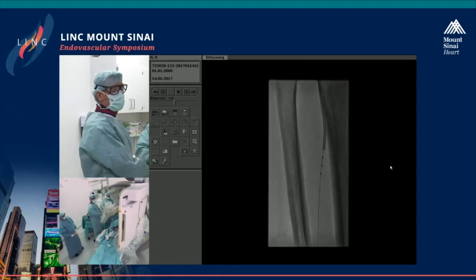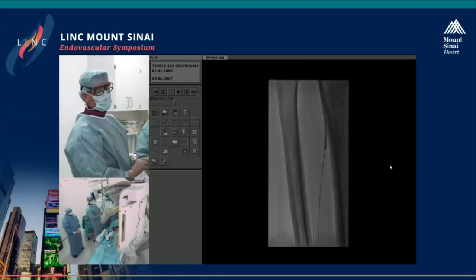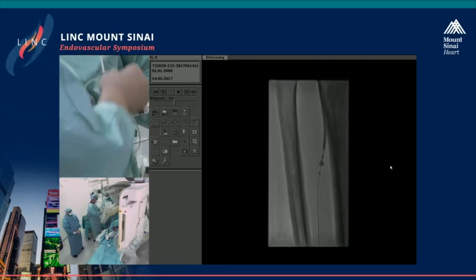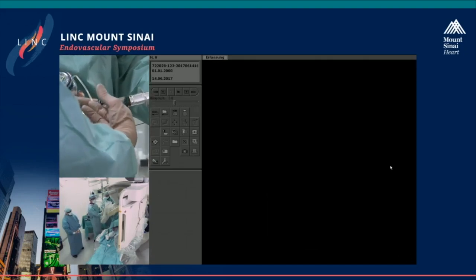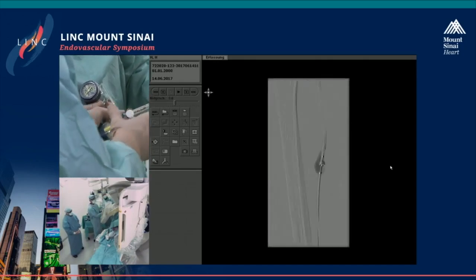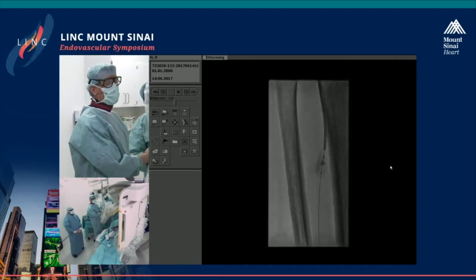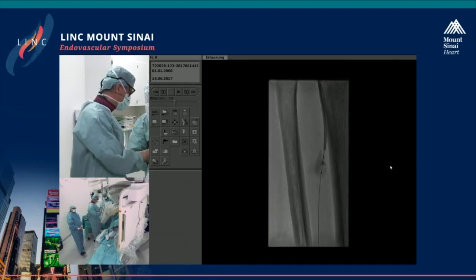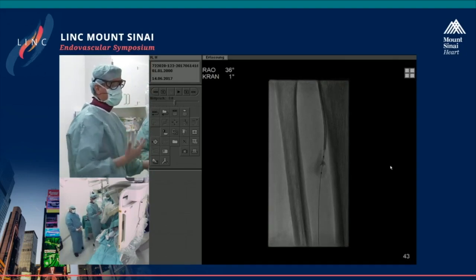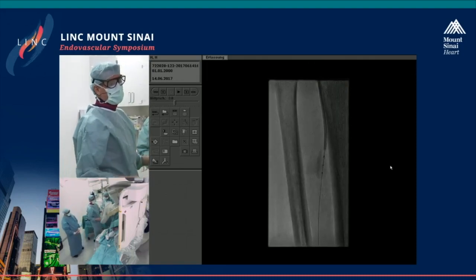So I twist the device now. You can see here, this is what is new with this device. I can take it to the other side and try here once again to take the needle in. And with DSA, it's just easier to see whether, this is what I want to see. That's how it should look. It doesn't look very nice if you're not familiar with this, but it's clearly not a perforation. This is really the surrounding tissue of the artery.